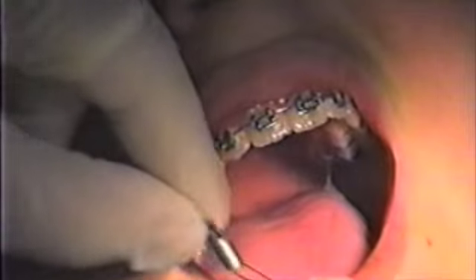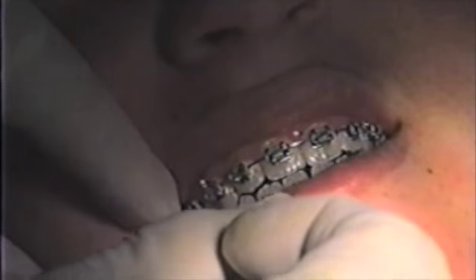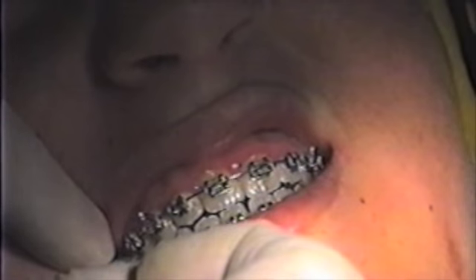This is a safe spring. When a patient is not cooperating, we will use a safe spring instead of an elastic — in this case, a class 3.